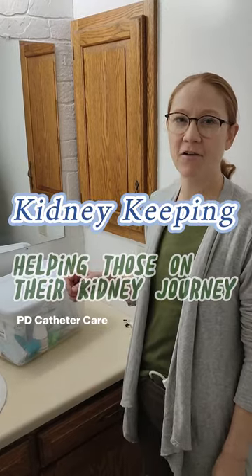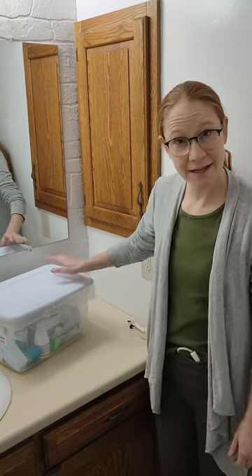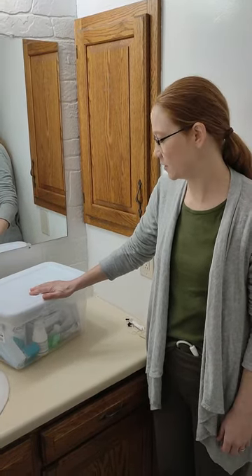Hello, I'm gonna show how I take care of my PD catheter. I store all the supplies here in this tub in the bathroom. This is just how I organize — you don't have to do it that way.